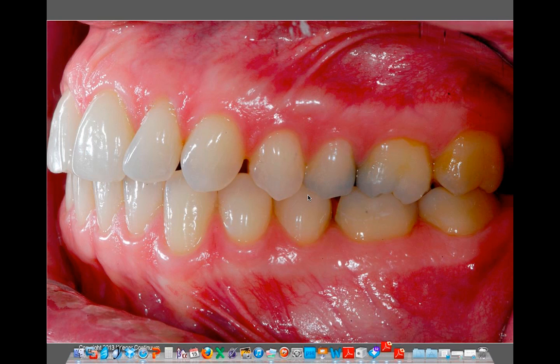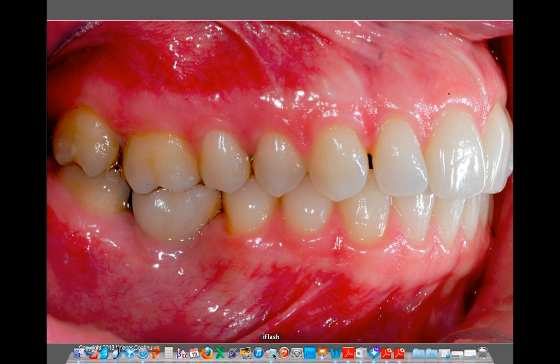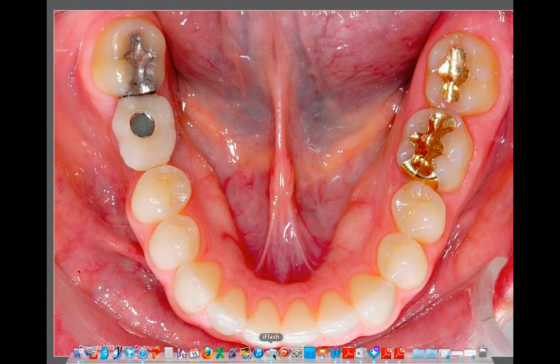And for those who know me, and some of you in this webinar know me, you know that these are my shots every single time. You can see on the top, there's some scratches on my mirror here and there. So I didn't pull you my finest images. I just pulled representative ones. So I take my left and my right laterals, proper angles classification, occlusal plane down the middle.